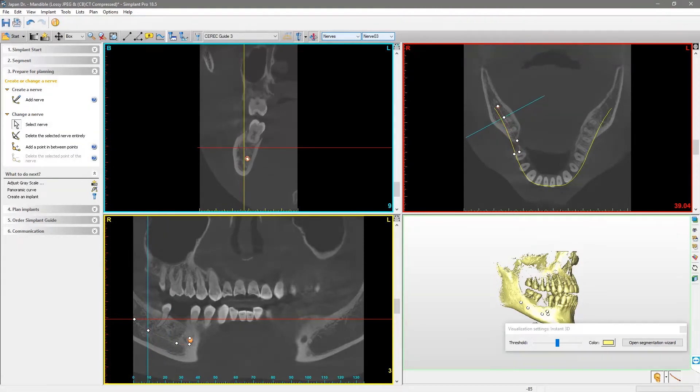If needed, you can adjust the position of each point by left-clicking on one and moving it to the preferred position.